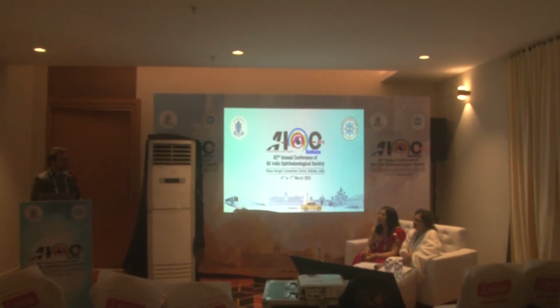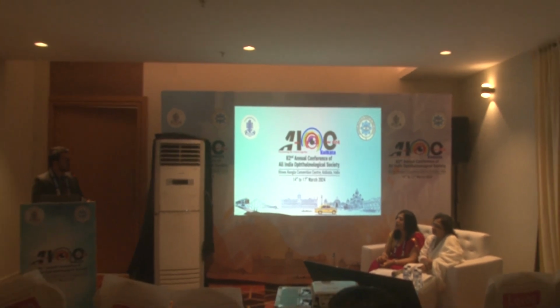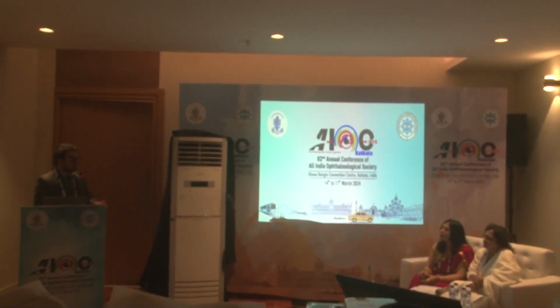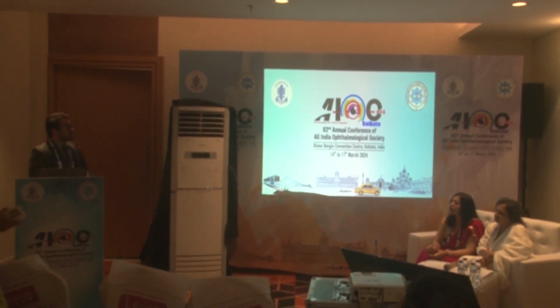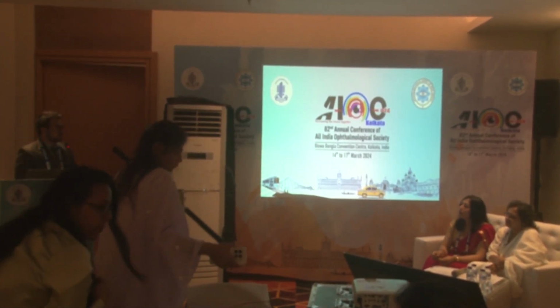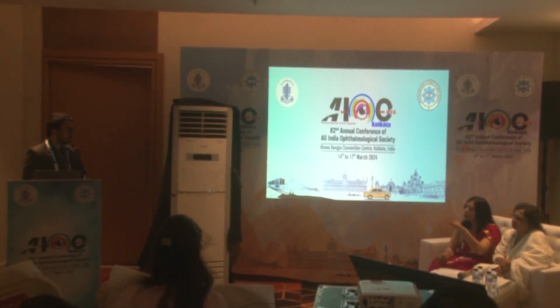Ma'am, the main challenges were focusing on the pathology, because while using the lens or while taking the photographs, the patient moves the eyes a lot. So the best is to communicate well with the patient that you are going to take 5 or 10 minutes and take some photographs for his benefit.